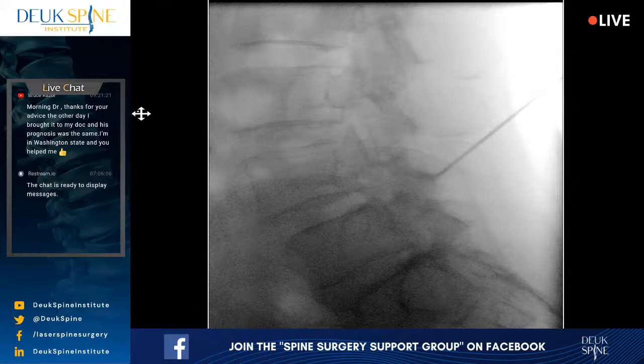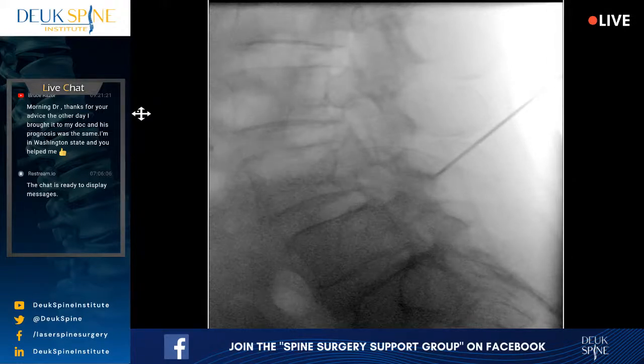And why would the spine be so difficult to line up? Basically because there's an element of scoliosis or twisting between the pelvis, the sacrum, and the spine itself, L5. And that twisting or rotation can throw things off. I don't think that's great. Actually, that may be the best we've seen so far. So let's see if we can work with that. Lock it down. I'm going to have to start a little bit lower than where I was. I should still be local there. I'm not sure why there wouldn't be.